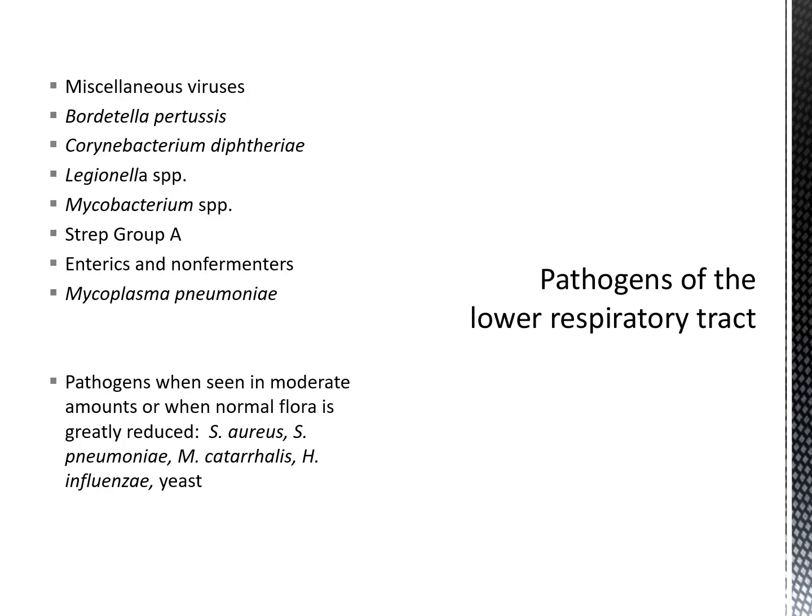Here we have a nice list of pathogens of the lower respiratory tract. Any virus, Bordetella pertussis, Corynebacterium diphtheriae, Legionella, Mycobacterium, Strep pyogenes, enterics and non-fermenters, and Mycoplasma pneumoniae. Remember, any amount of Strep A, even if it's just 1 or 2 colonies, is considered pathogenic.